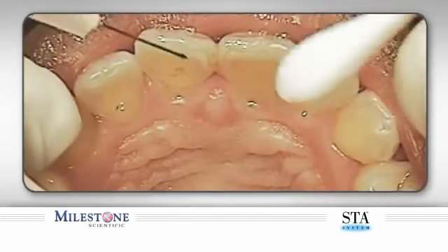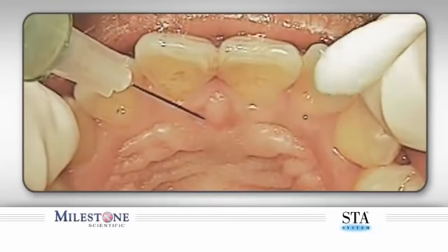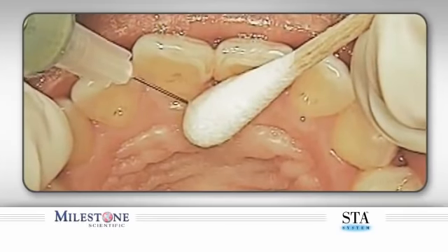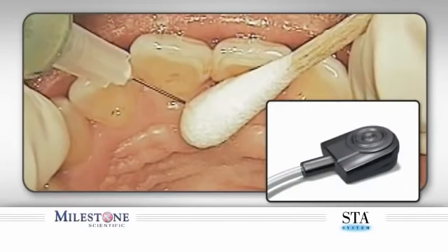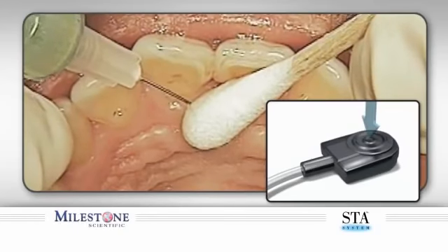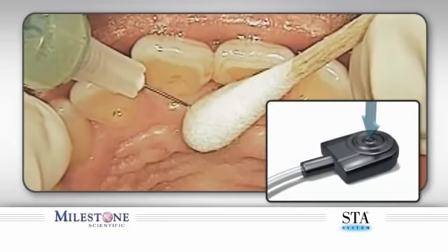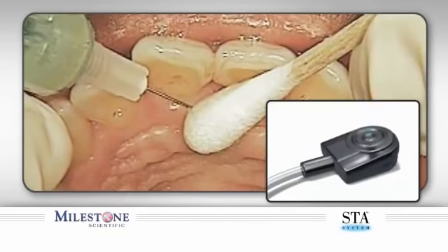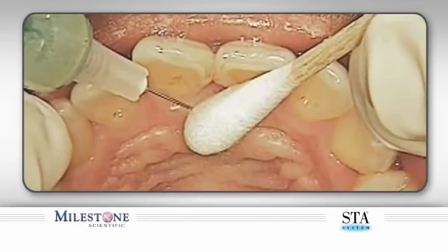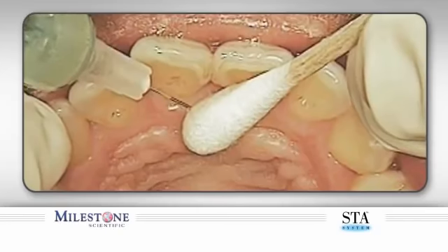We will now show a clinical example of the PASA injection being performed. You can see the needle is applied to the surface of the palate, followed by the placement of a cotton applicator. The flow of anesthetic is begun by initiating the STA cruise control. Once the needle bevel enters the tissue, pause forward movement for an additional 4 to 5 beeps before advancing again. Next, simultaneously advance the needle 1 to 2 millimeters while rotating back and forth.